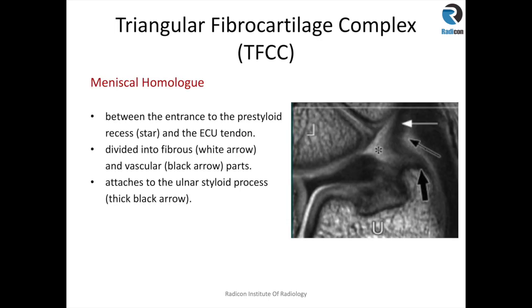The meniscal homolog is between the entrance to the prestyloid recess and the extensor carpi ulnaris tendon, and it divides into fibrous and vascular parts. The fibrous part and the vascular part — which is a bit more hyperintense — attaches to the ulnar styloid process.